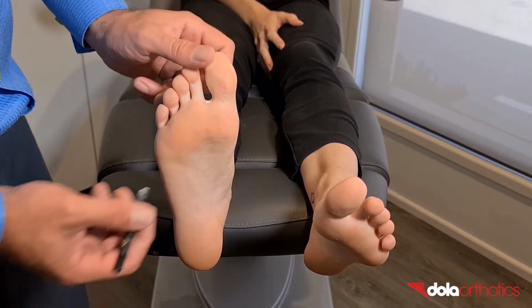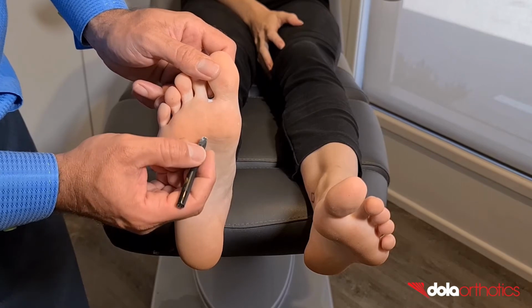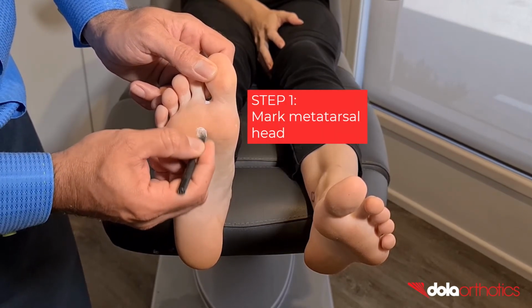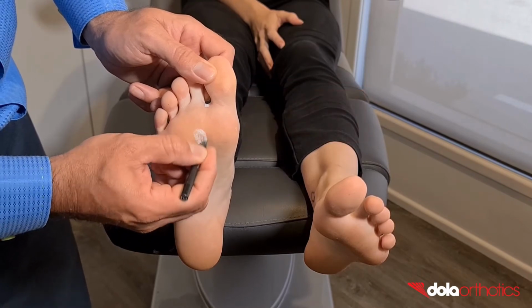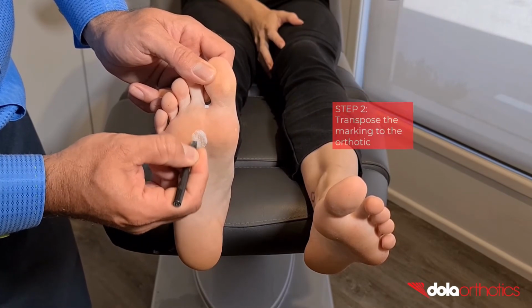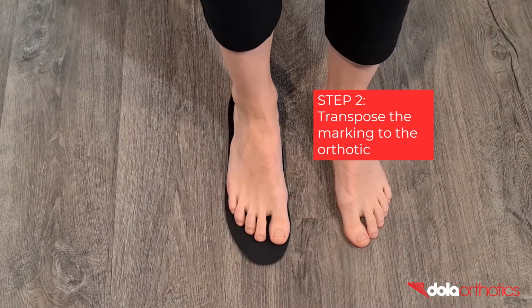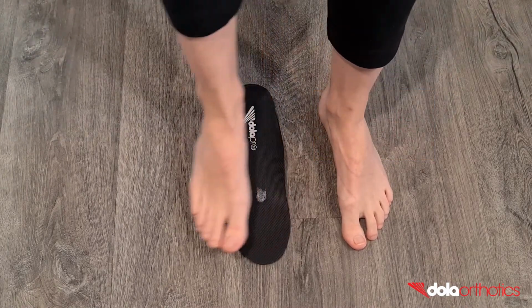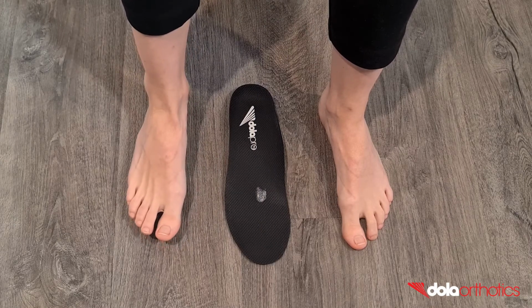An accommodation involves marking the position of the metatarsal head on the orthotic device. Step 1. Use a pen or lipstick to identify and mark the metatarsal head on the foot. Step 2. Stand on the orthotic to transpose the weight-bearing position of the metatarsal head. You now have your area marked as a guideline for grinding.